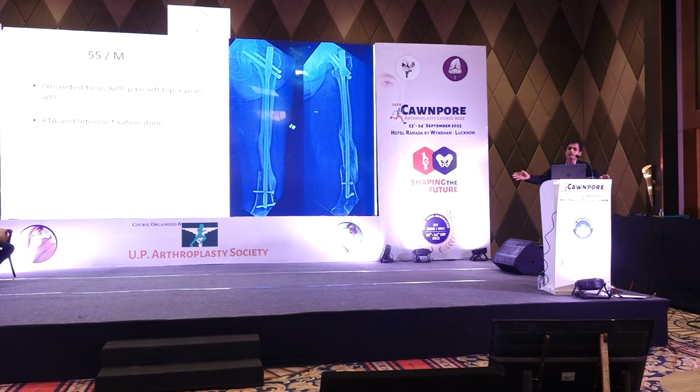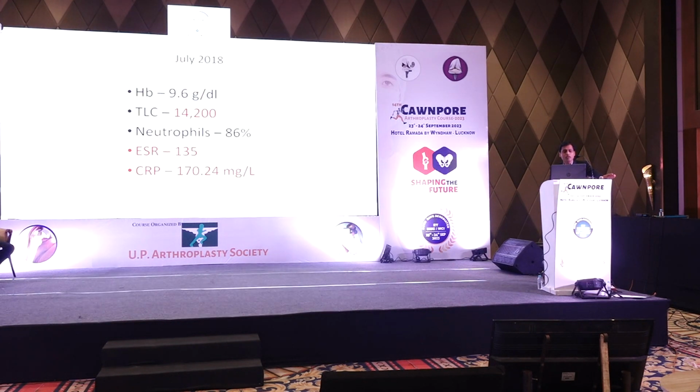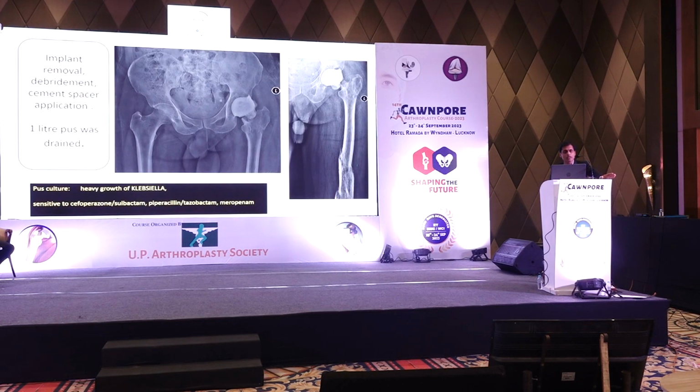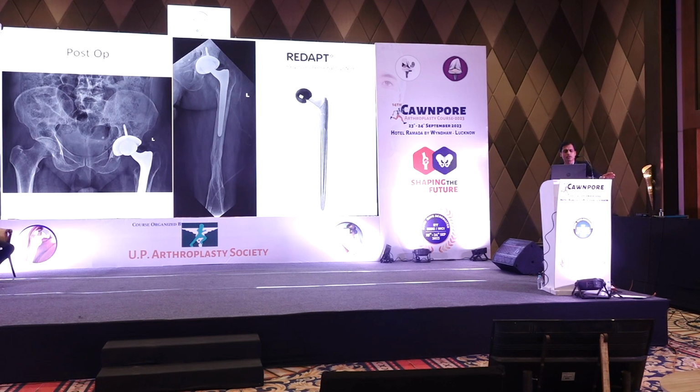Sometimes we also discuss infection. This is a case where 3 years back a patient underwent a distal fixation. Multiple open fractures, multiple fixations. You can see the blood investigations show very high CRP and ESR. So the best is to remove the implant, do a thorough debridement, put in a cement spacer, take the culture, treat appropriately, and then go ahead with a second stage procedure: a titanium distal loading stem and an uncemented cup.